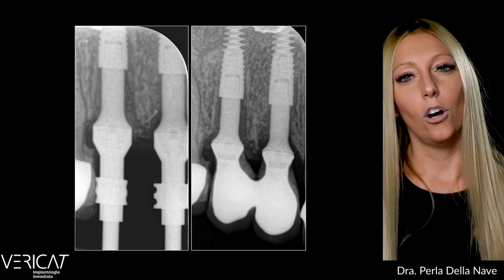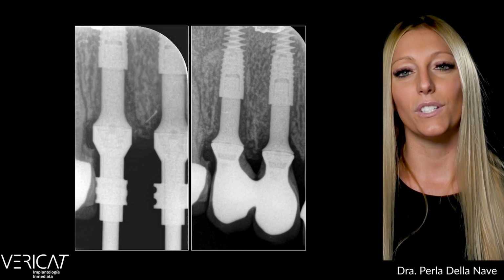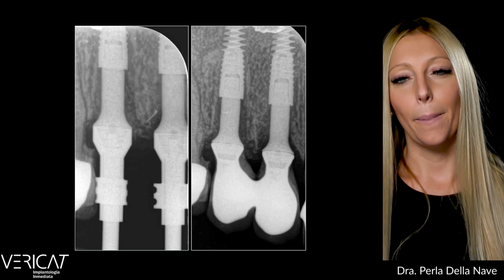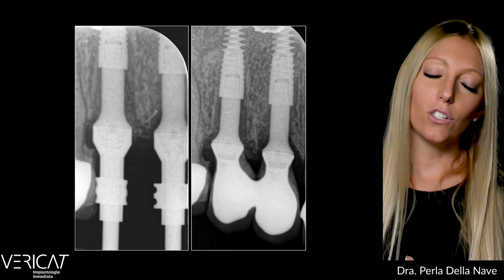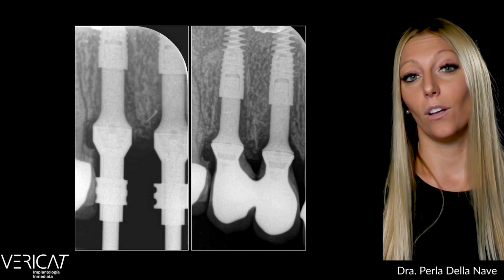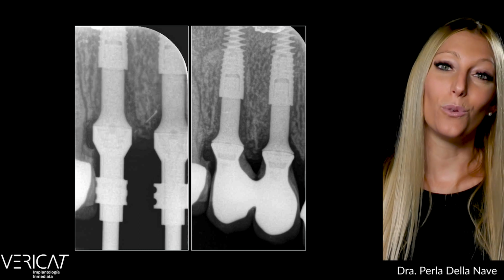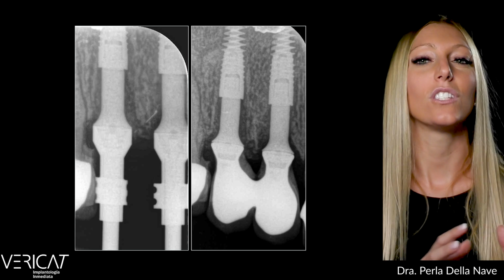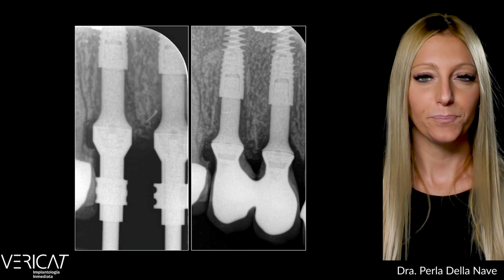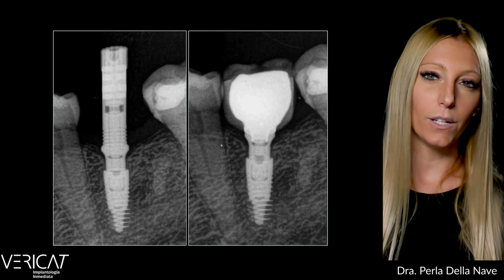The same. Observe here, please, the depth, the height of the abutments, and the beautiful preservation of the bony papilla between these 2 post-extraction implants. When we place post-extraction implants with a flapless approach without carrying out any regularization of the crestal portion, we always like to place the implants into an even deeper position to protect them from that post-extraction physiological resorption that we already know will occur. Once more, the marginal bone remains 2 millimeters above the implant shoulder.